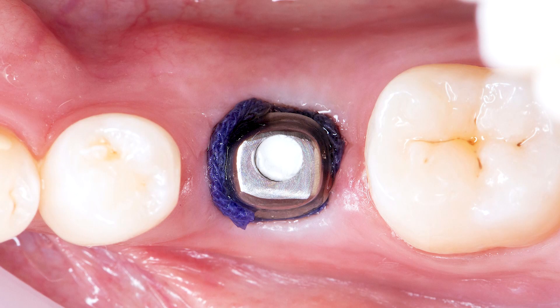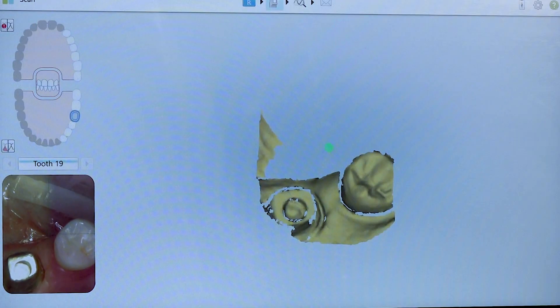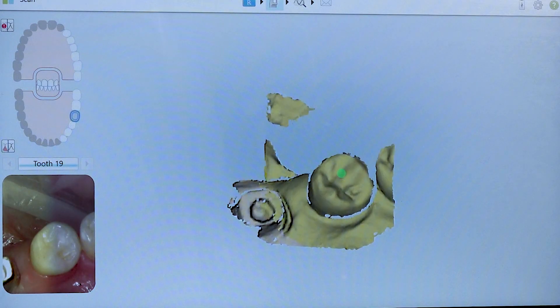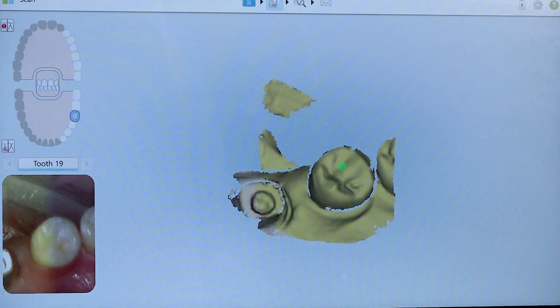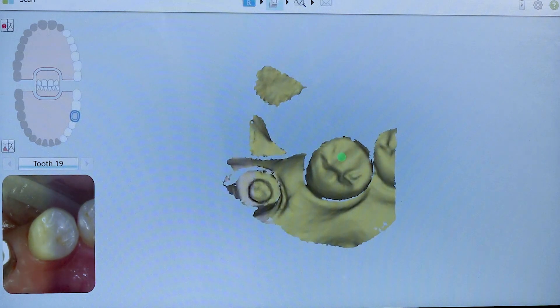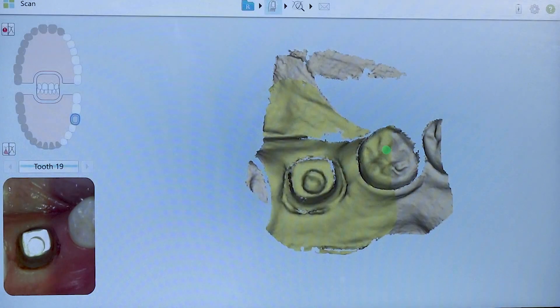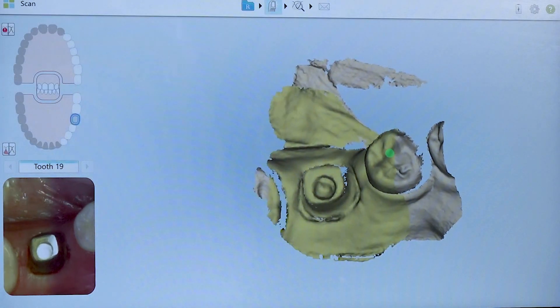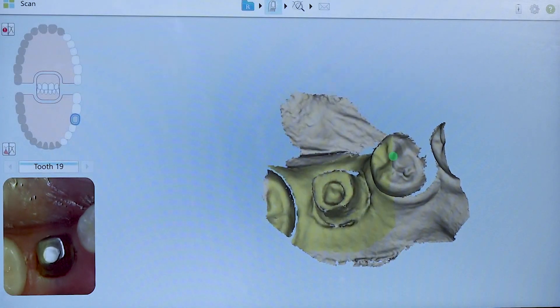On our second scan, we placed retraction cord. After 5 minutes, the cord was removed and the scan was captured. When the tissue is displaced, the margin of the abutment is easily identified.